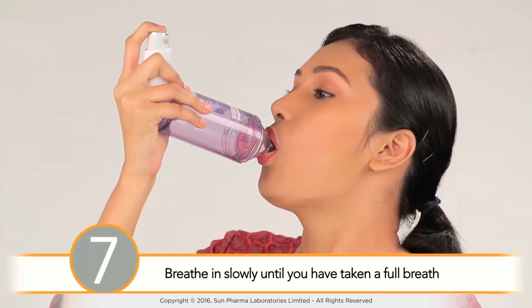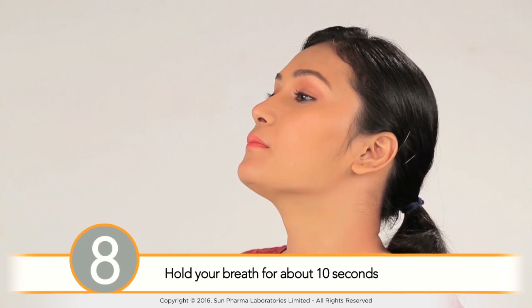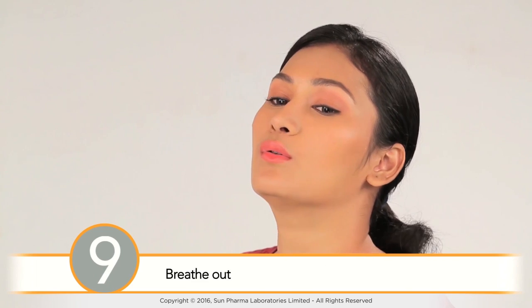Breathe in slowly until you have taken a full breath. Then remove the spacer from your mouth and hold your breath for about 10 seconds to allow the medication to reach the airways of the lungs, and then breathe out.